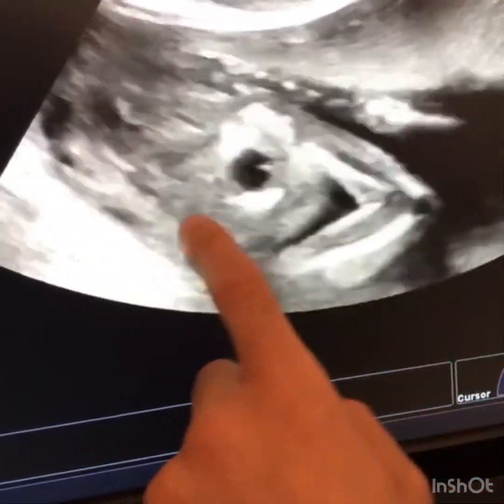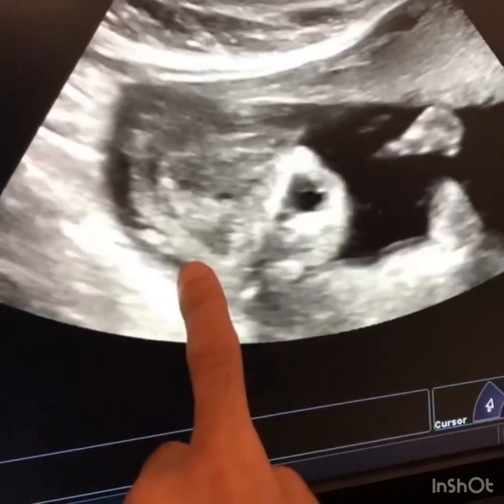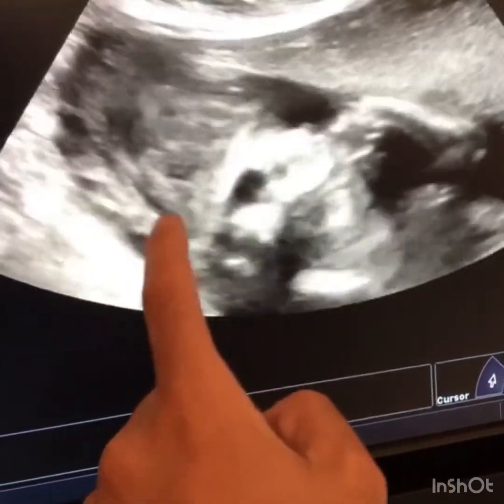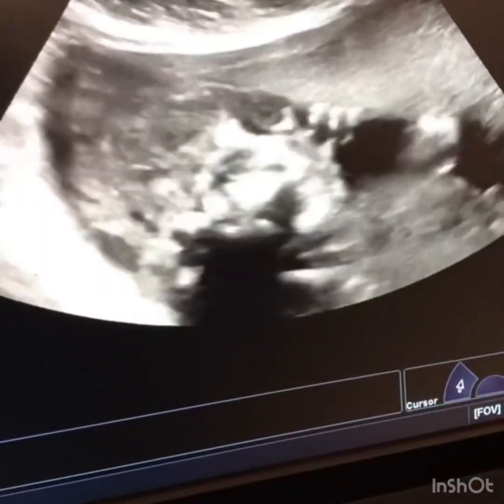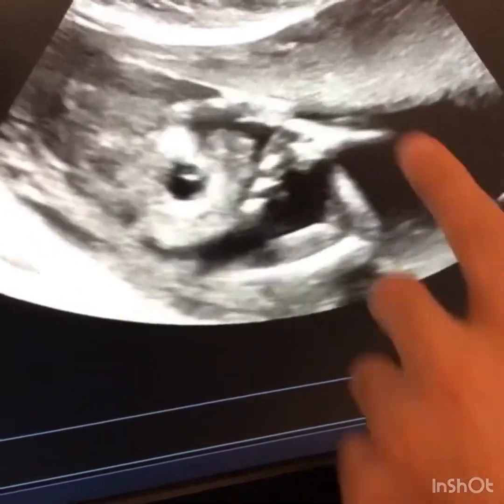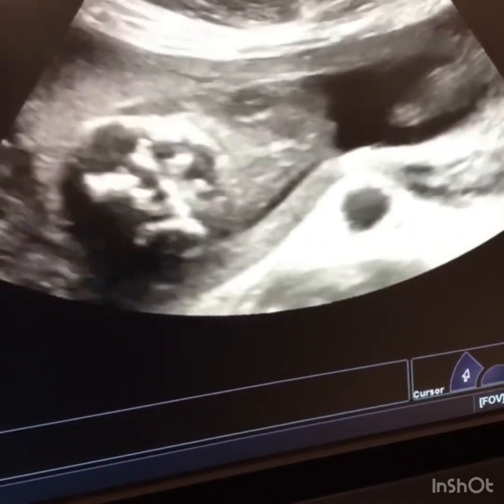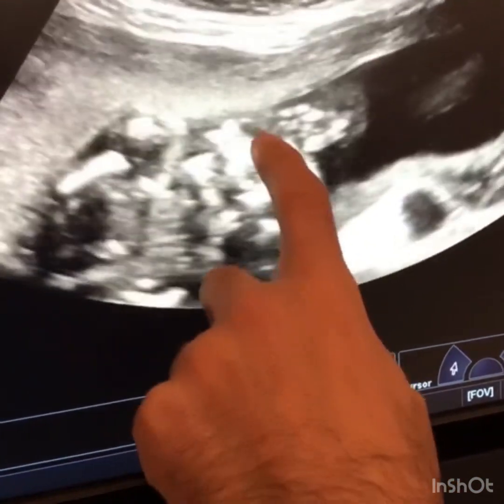We can see the eye, both hands, and above the eye we can see brain tissue with no protecting calvarium. The brain is floating in amniotic fluid. Both hands, eyes, and nose are seen in this fetus. Here we can see the complete brain tissue with no calvarium.